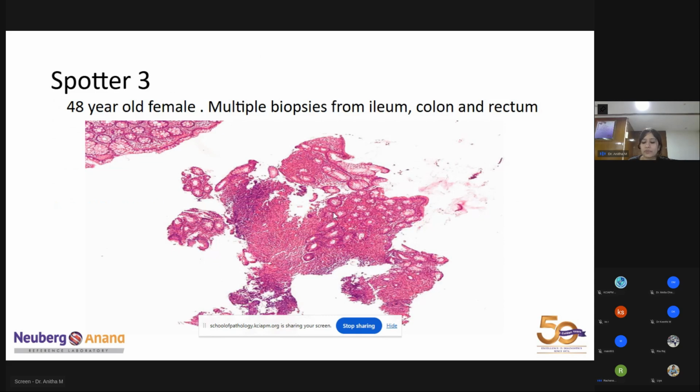So shall we go ahead with the spotter? So there's a next spotter.